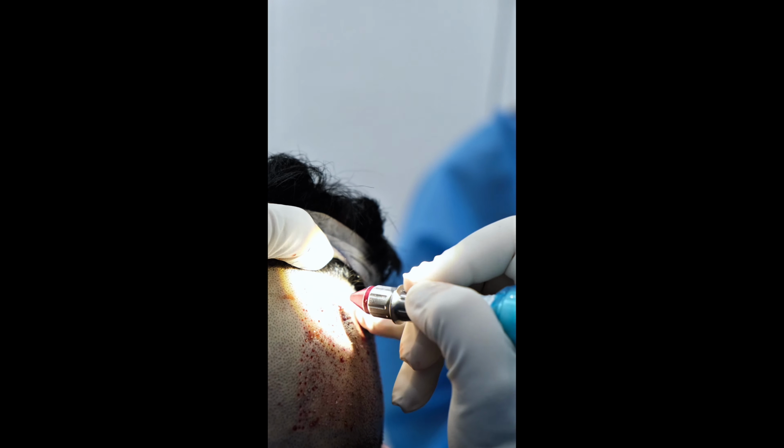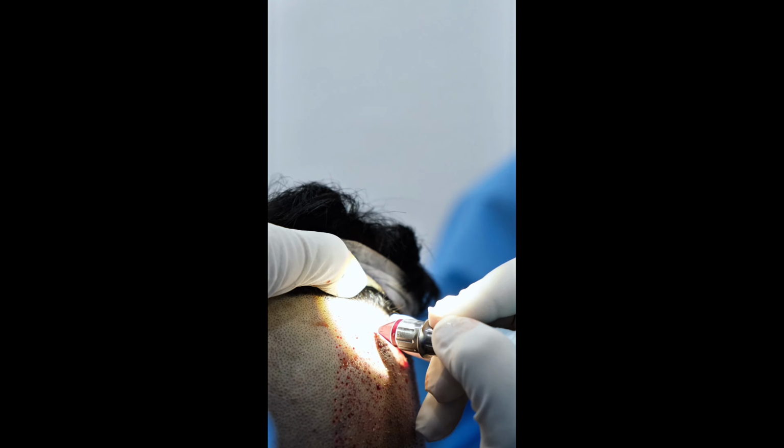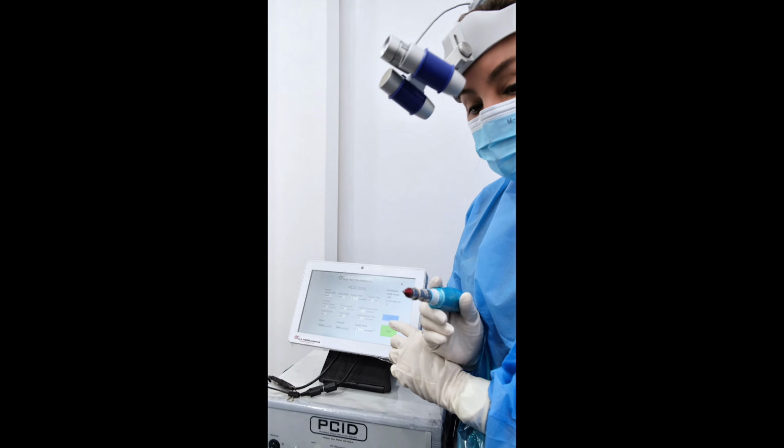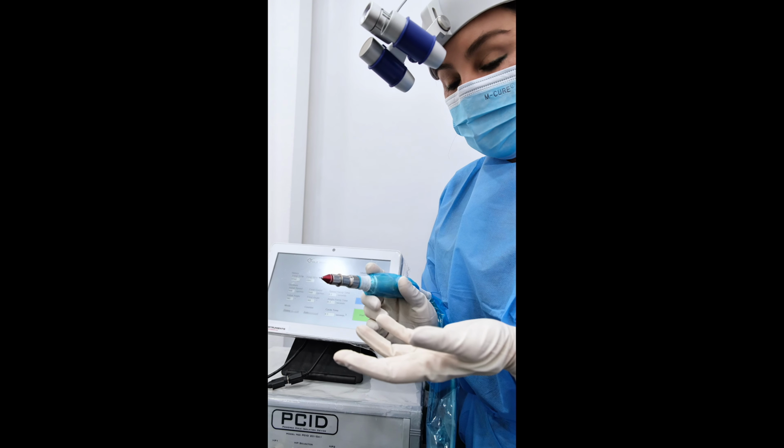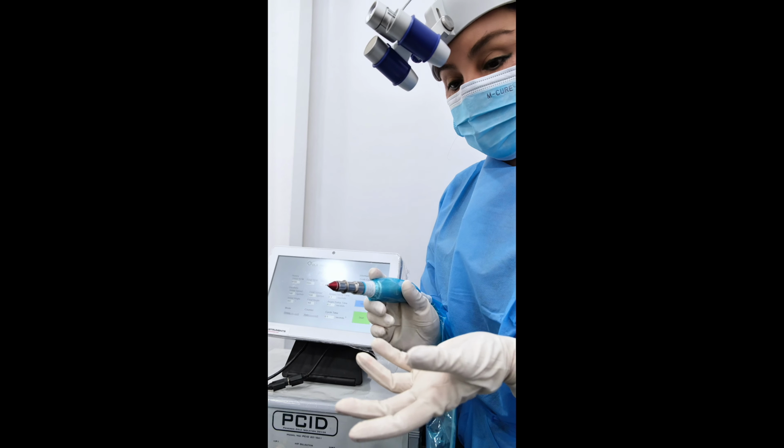Just score and guide the whole punch inside. And this is how you do it. Every patient has a different setting, depending on how deep the follicle is, or the angle of the follicles, and also the type of the skin, whether it's a surface skin or a hard skin, and we will monitor it.